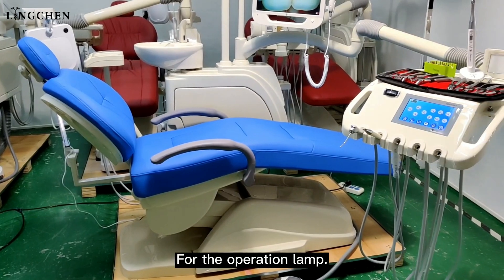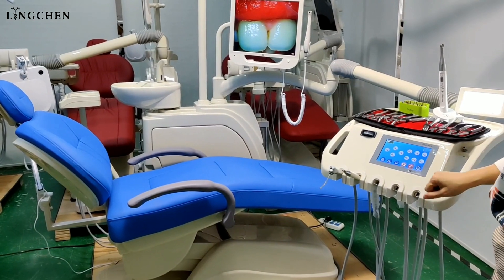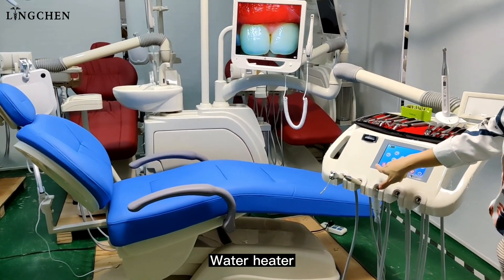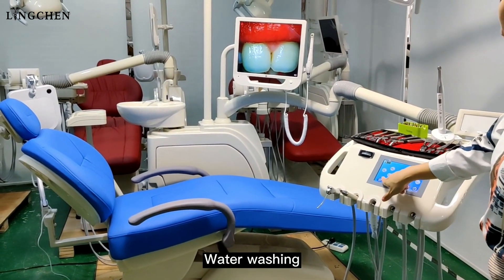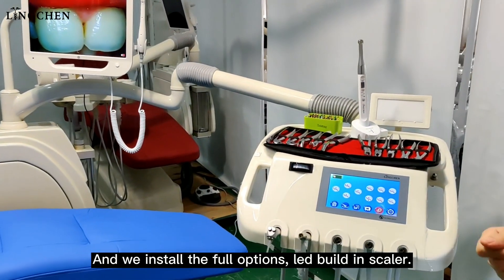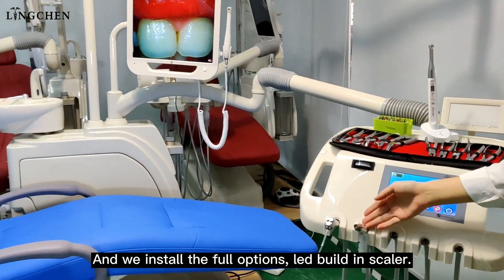There are dedicated controls for the operation lamp and for the x-ray viewer. A water heater is also included, along with water washing, water dispensing, and an LED built-in scaler option.